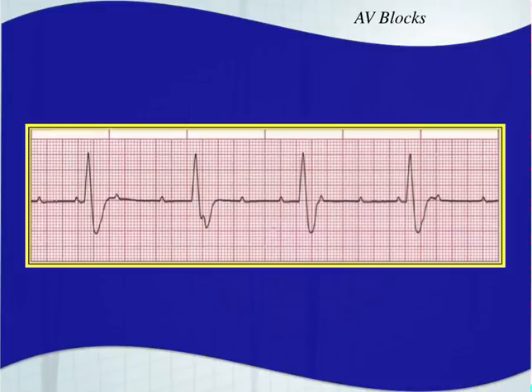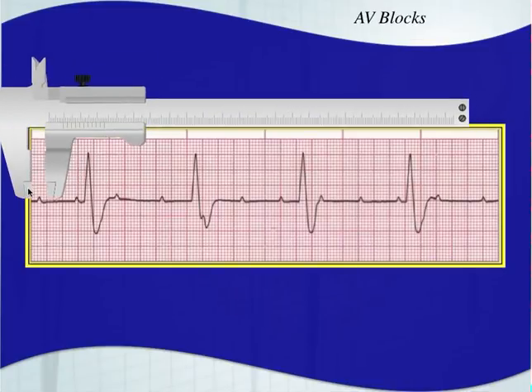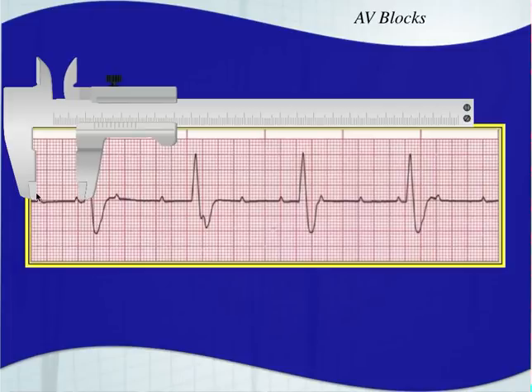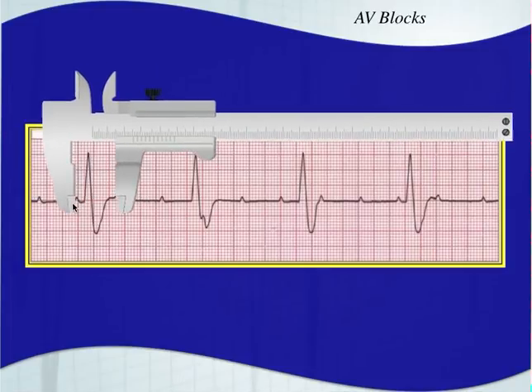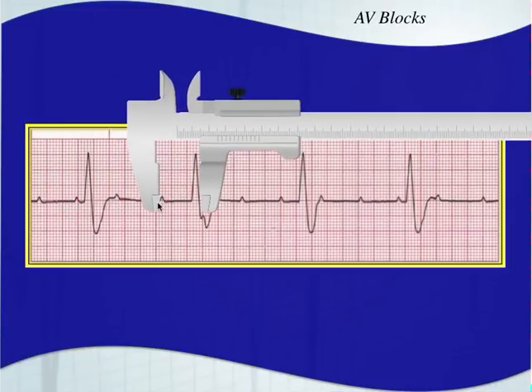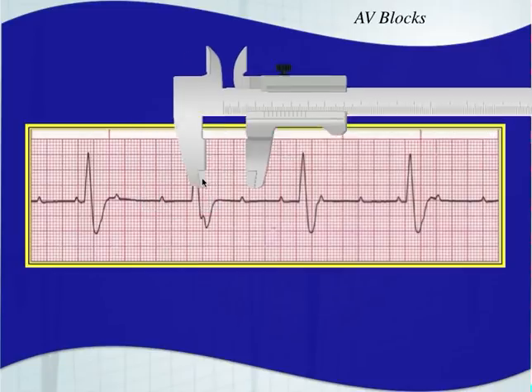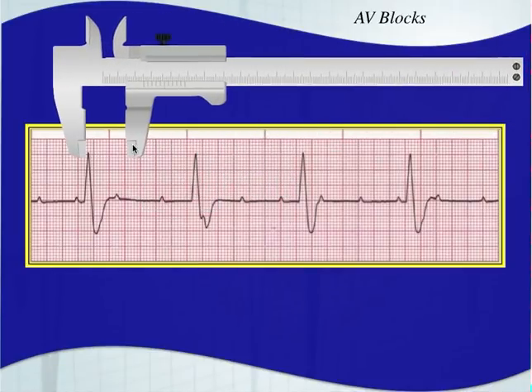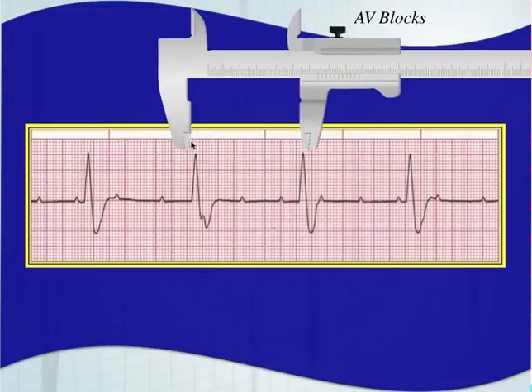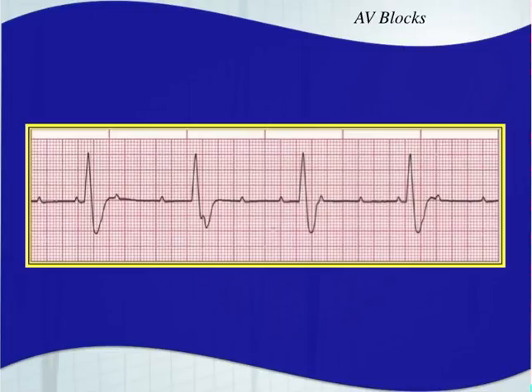Next strip: is the PR interval a constant length? You can clearly see this one is way longer than this — it's not constant. Do we have a P wave for every QRS? These are not associated. The P-to-P intervals are just marching out, with a hidden P wave visible at the bottom of the S wave. Your QRS complexes stay regular — R-to-R interval stays regular. So this is a third degree AV block — complete AV dissociation. P-to-P will be the same, R-to-R will be the same, but they are not associated with each other.